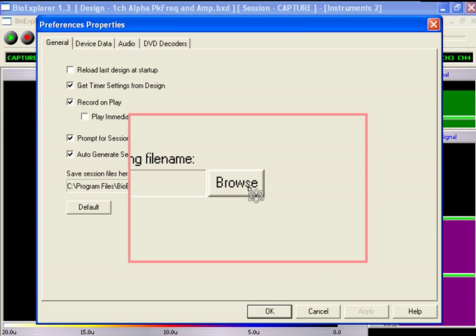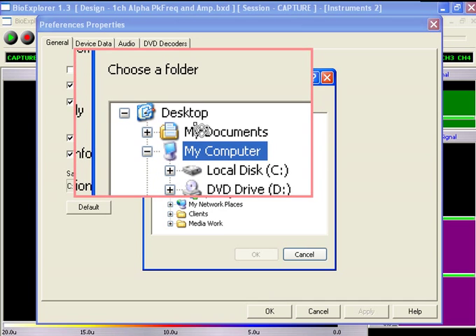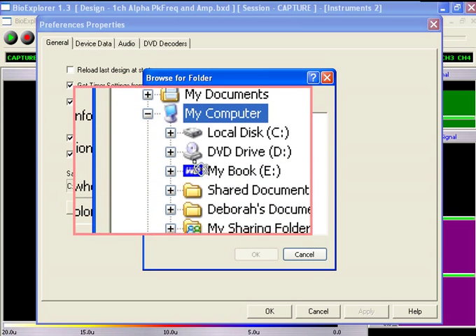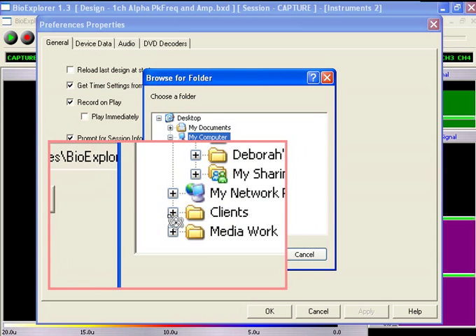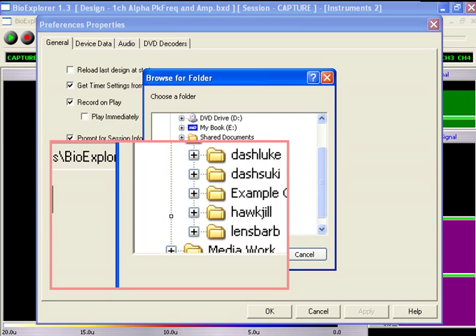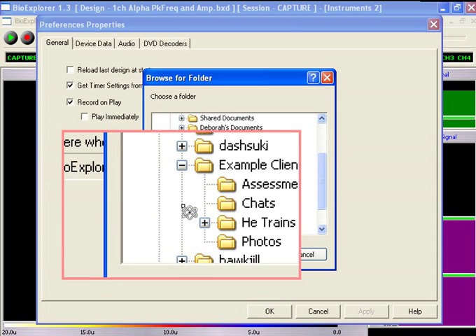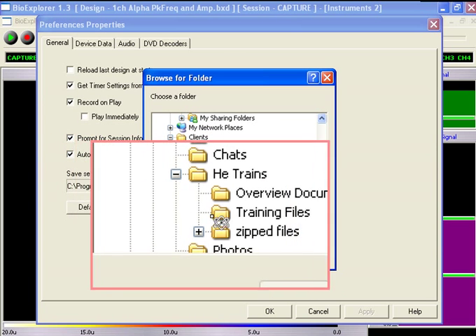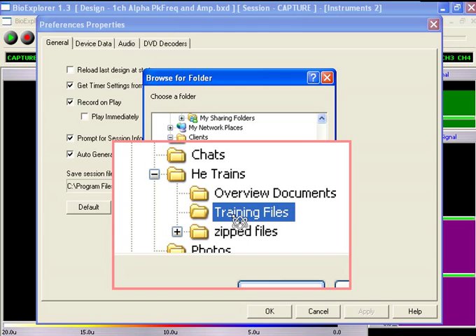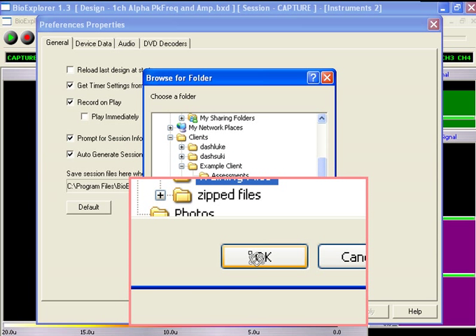So click Browse. Bio Explorer automatically opens at the highest level, the desktop. So by putting our folder on the desktop, we avoid having to navigate through the C drive in the Bio Explorer program. Click on our target folder and OK.